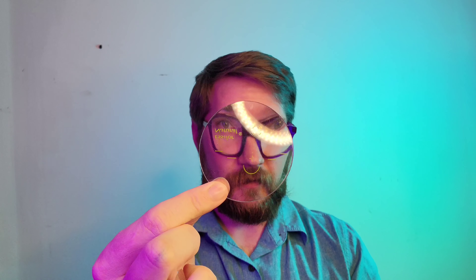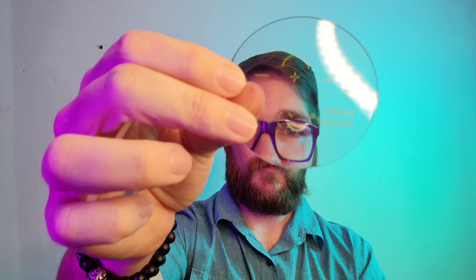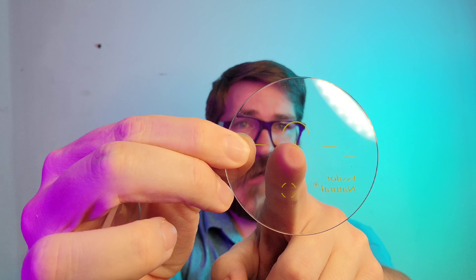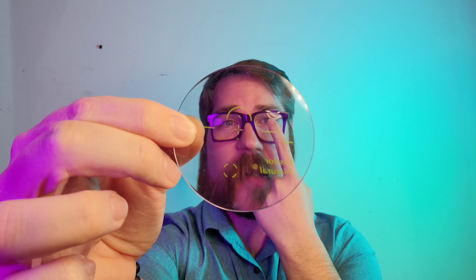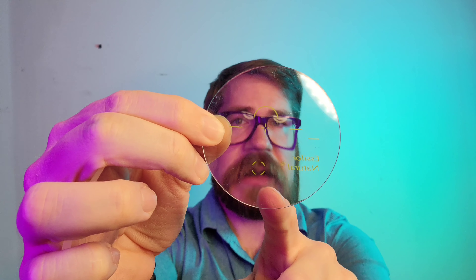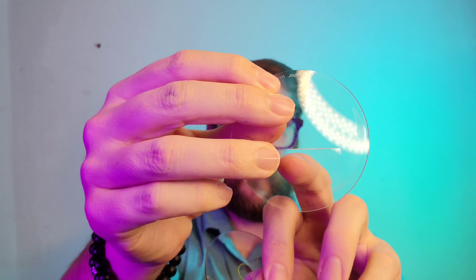And then there are progressive lenses — I'm showing this upside down because it just works better on camera so you can see the distortion in my face better. This is your modern-ish progressive lens, where the power at the distance is what you need for distance. It gradually changes from the point right in front of the pupil on either side of the glasses, and that gradually increases in power as you get through here — that's why you have this little bubble around through here — to your near zone.